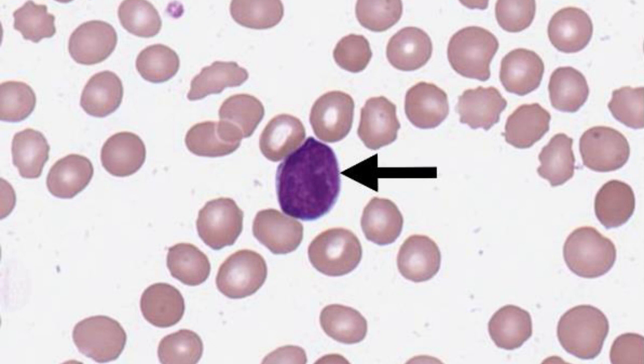Mukha siyang reactive lymphocyte. How do we differentiate them? In blood smears, it may be difficult to distinguish reactive lymphocytes from lymphoma cells or lymphoblasts. The most important distinction between these cells is the difference in their N/C ratio. The N/C ratio tends to be low in reactive lymphocytes, while it is typically high in lymphoma cells and lymphoblasts.